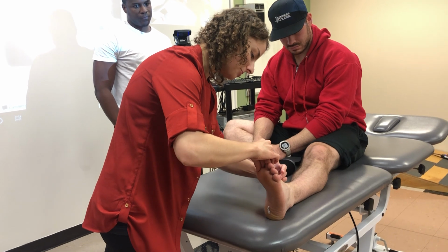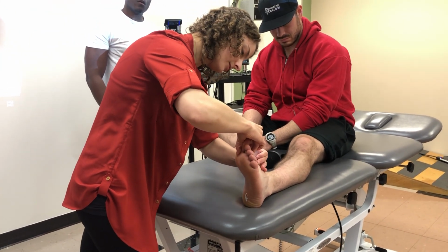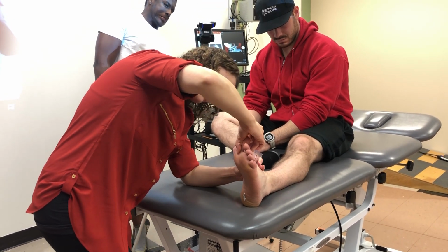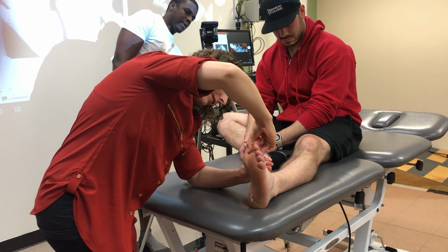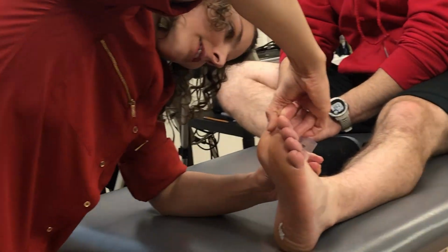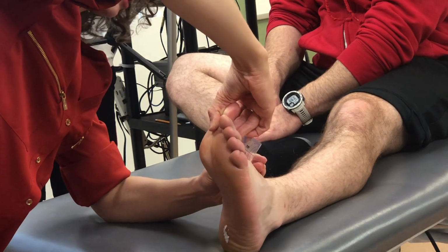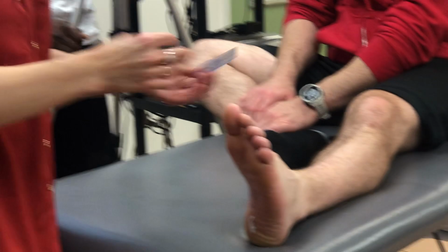And then you're going to take them into extension from there. Okay. All right. So he has 68 degrees, which is great. 70 is what's considered optimal. So 70 degrees is optimal.